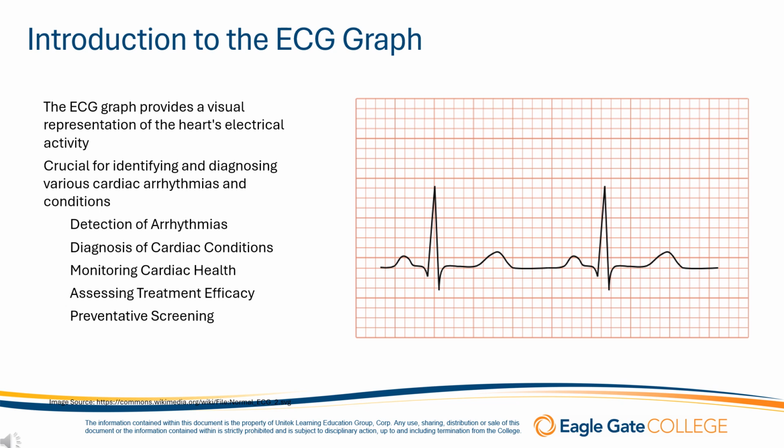When patients are treated for cardiac conditions, whether through medication, surgery, or other interventions, the ECG graph provides immediate feedback on the effectiveness of the treatment. Changes in the ECG can indicate whether a treatment is working or if adjustments are needed.